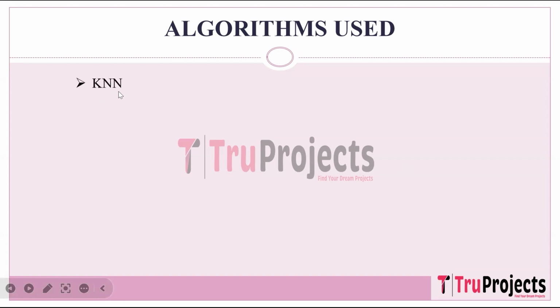The first algorithm is KNN, K nearest neighbor. KNN is a simple and effective classification algorithm that classifies data points based on the majority class among the nearest neighbors. KNN is used for classifying brain tumor images based on similarities with labeled images in the dataset. Coming to the next algorithm, which is logistic regression. Logistic regression is a statistical method for modeling binary outcomes using a logistic function. Logistic regression is utilized for binary classification tasks in brain tumor detection, such as determining the presence or absence of a tumor in an image.